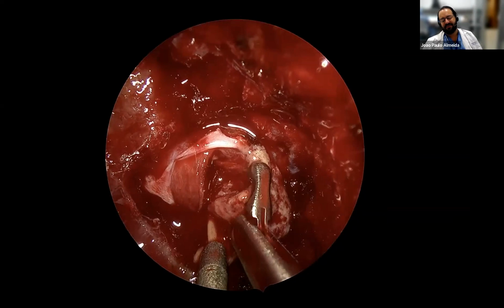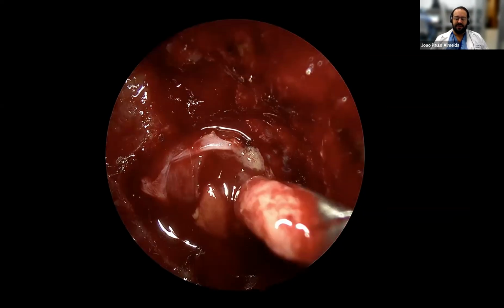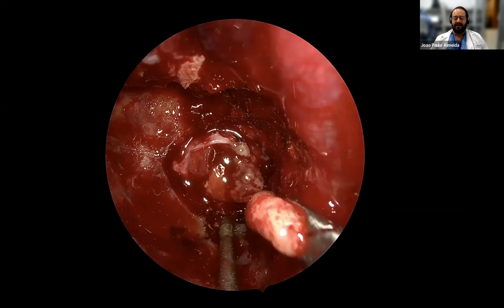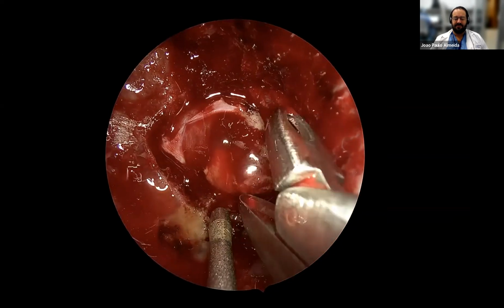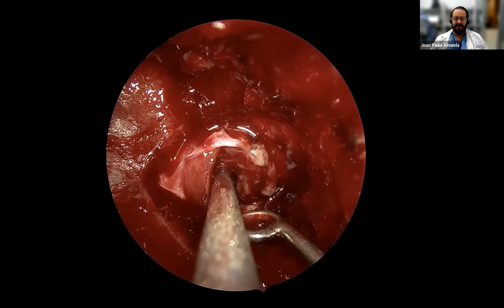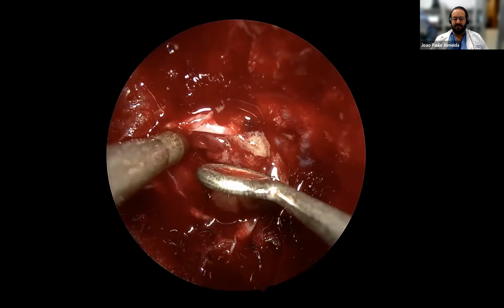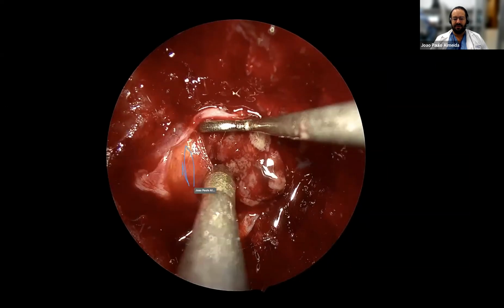Once you found the plane, you quite often have to debulk a bit, and that's what we're doing here. And then sending, of course, tumor for pathology and so on and so forth. But trying to preserve the separation planes between the normal gland and the abnormal tissue. So you see the normal gland, orange, and the tumor here in yellow.